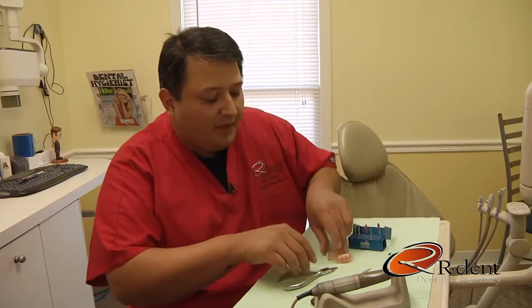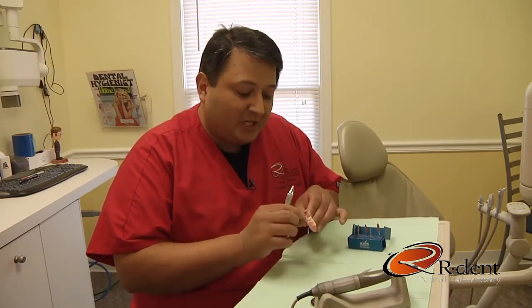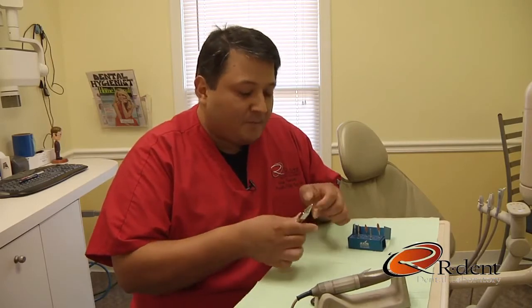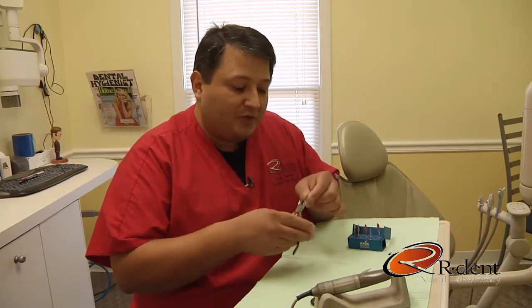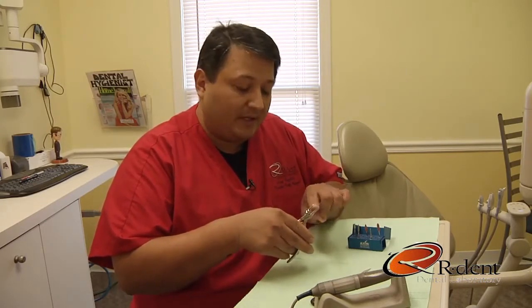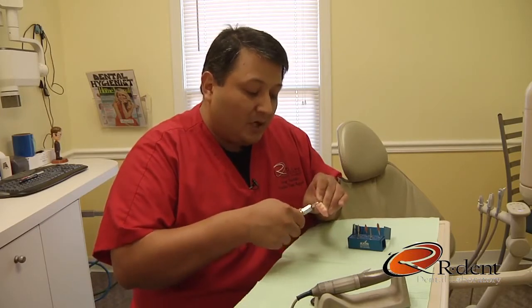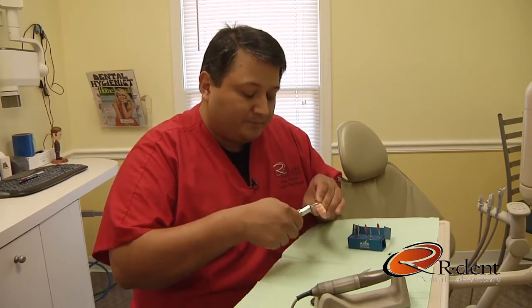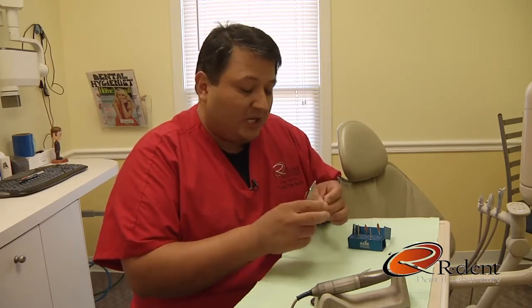Final tip: when seating a Valplast partial and you notice blanching around the gingiva of the abutment teeth, before relieving the tissue side of the partial, use some basic orthopliers with no grooves or teeth, grab the clasp at the base of the partial, and bend upward toward the abutment tooth. The clasp will hold its position, and you will not sacrifice the original design of the partial.